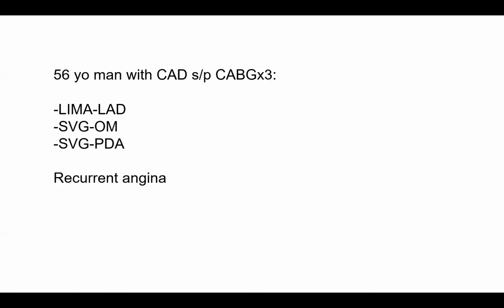I will dissect graft cases step by step. Those are practical cases that we see every day. I will start with this standard case.